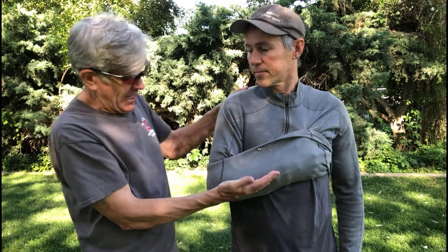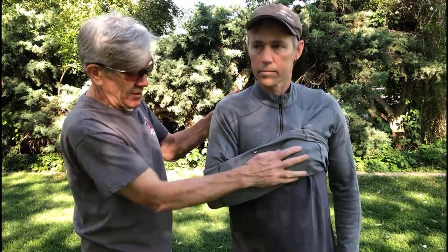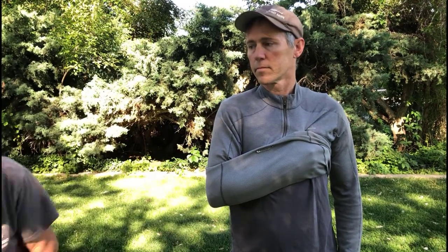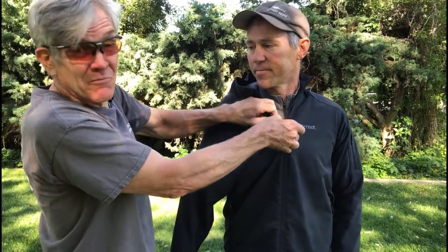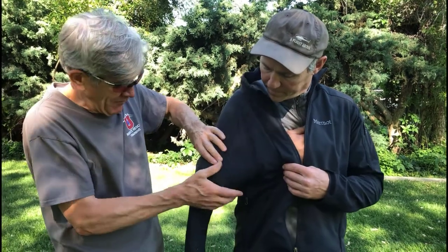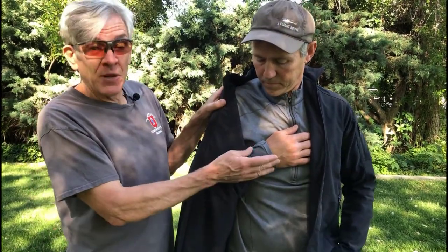Here's an example of slinging with almost no equipment — all we've used are two safety pins and the patient's shirt. You can see it keeps his hand high and still provides CSM access, giving great support for his arm. It doesn't, however, do a very good job of trapping that elbow. One way we can create a swath for this is simply by putting a jacket around the patient. Another way to support an extremity injury with no gear is to put the patient's elbow into the sleeve area itself, which both traps the elbow and provides support — not as good as a sling and swath, but in a bind it does provide some stability.